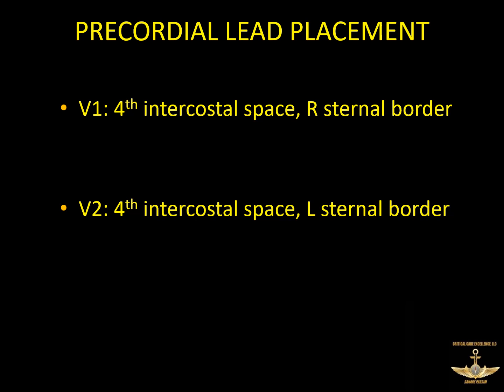That brings us next to the chest electrodes, or the precordial. And that's really what precordial means, is chest. So the precordial lead placement, this is leads V1 through V6, and those leads are going to be labeled accordingly. So each one of these has a very specific point, either based on anatomy or based on the placement of other electrodes. So V1 and V2, and these are probably the most important ones, because where you place a lot of the rest of these stickers is going to be based on where you put V1 and V2.